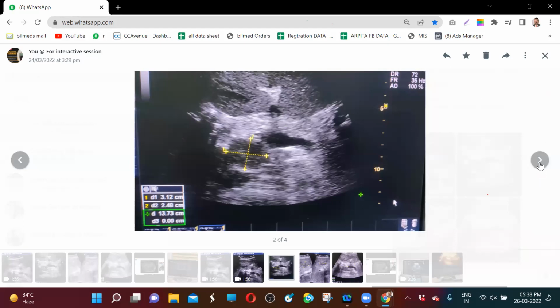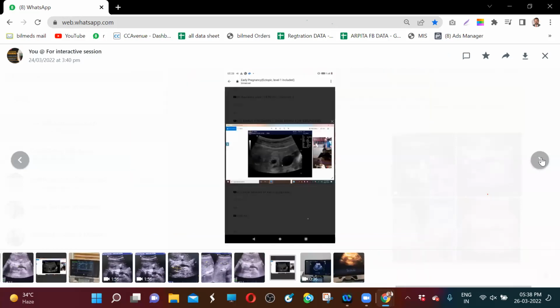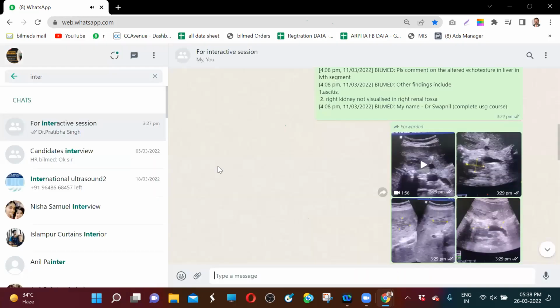Sir, it was not taking color. I remember that. Now see, this is the case where you are suspecting whether to label this or that. I am concluding the findings are going more in favor of a focal spared area, but 100% I cannot say because I have to put a Doppler to see for any mass effect. How to see for any mass effect, you better know now. Anything else? So these were today's questions, which I showed you as they are, received on WhatsApp.